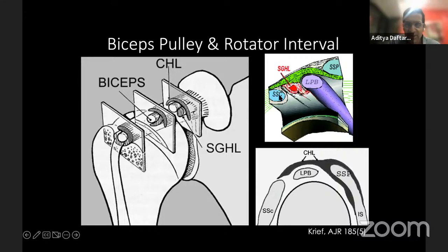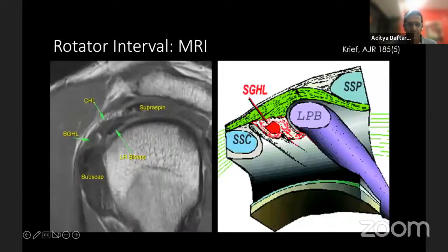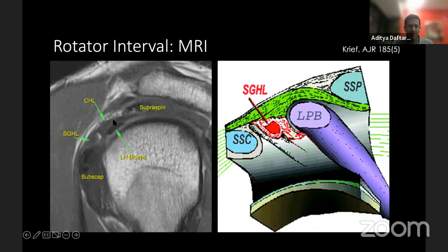On the sagittal image, you'll see the subscapularis, the long head of the biceps, and the supraspinatus. The coracohumeral ligament goes over it, and the superior glenohumeral ligament runs anterior. Here's the MR equivalent at the rotator interval: this is the supraspinatus, the coracohumeral ligament, the superior glenohumeral ligament, the subscapularis, and the long head of the biceps.